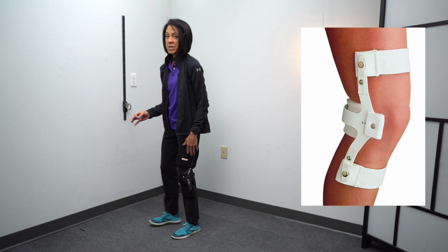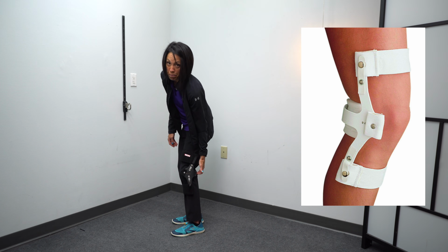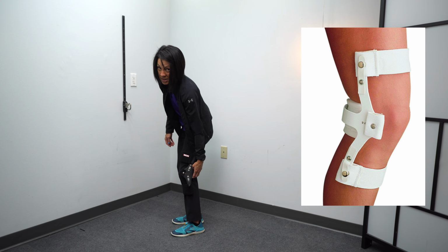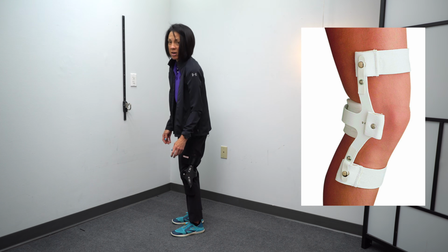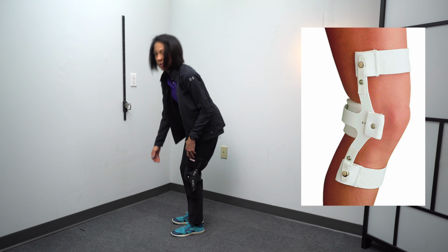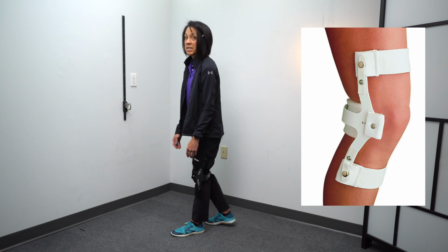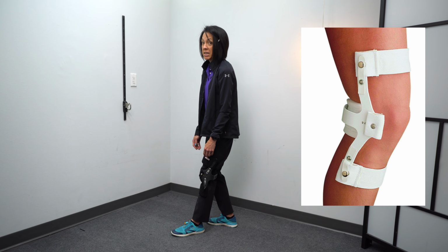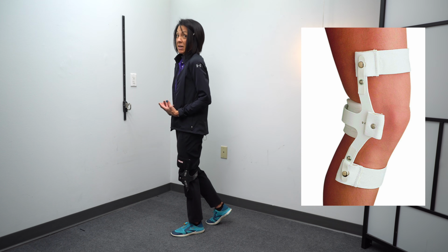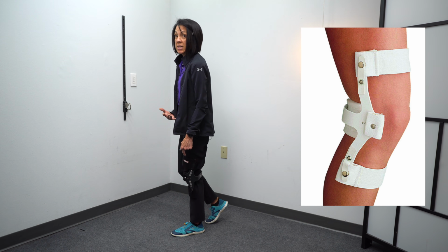But now, what does a Swedish knee cage do? It has an actual bar, a very, very strong bar that goes right behind the knee. It's padded, so it's not uncomfortable. And then a strap goes above it and below it in the front of your knee. What it does is it keeps your knee unlocked. So if I'm someone who hyperextends because my foot is pointing, now all I really have to do is focus on getting my hips over my foot, and my ankle's going to dorsiflex. Do you see that?